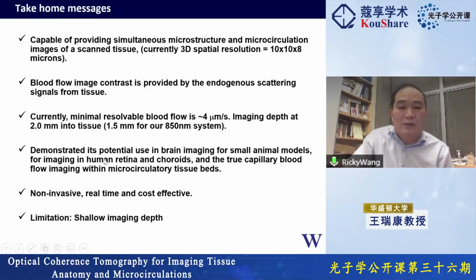Of course, the most important application is in ophthalmology, and you can also use OCT to look at neurological diseases, Alzheimer's and aging. The most important thing about OCT is that it is non-invasive, real-time, and very cost-effective compared to MR imaging, X-rays and ultrasound.